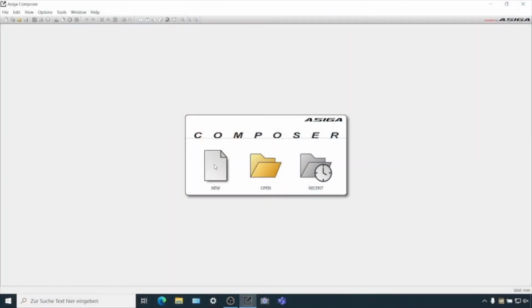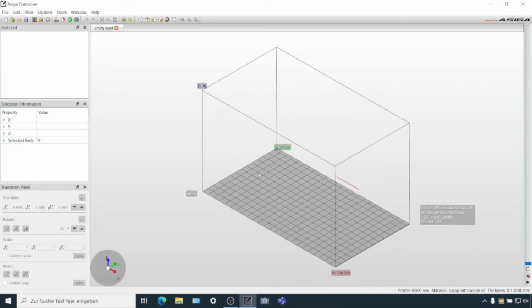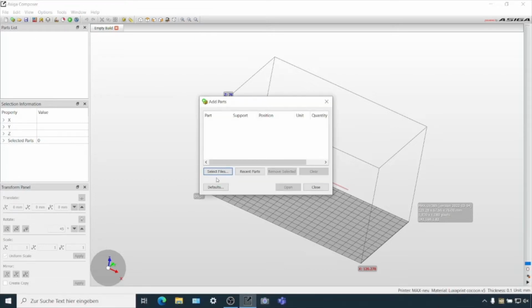Here's the Composer software. We open a new build style, a new platform for the Asiga Max. We select the Luxaprint Cocoon material. The slice thickness is 0.1 millimeter. Let's open it. Now we select here on the left side of the desk the button Add Parts.